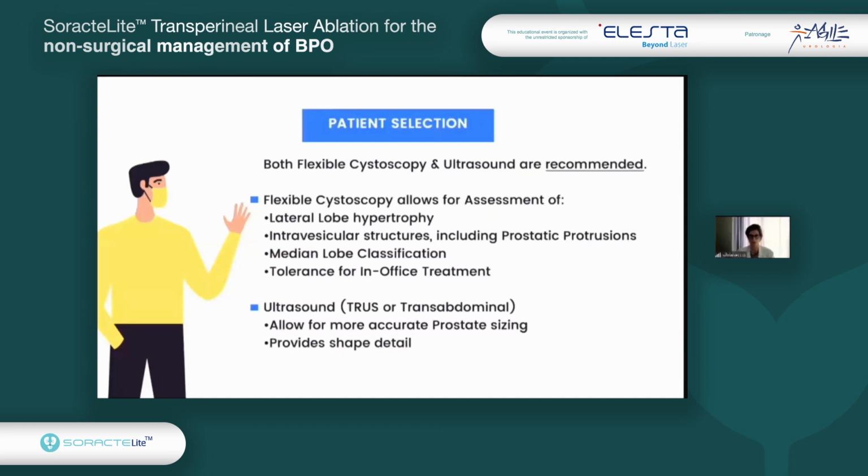It can be a transabdominal or transrectal ultrasound, but we have to know how the prostate is in terms of dimension, in terms of shape, and whether there is any kind of stenosis or something that can make the procedure difficult. So we have to collect as much information as we can to be sure that the procedure will have no complication and no contraindication. The fact that the patient uses anti-aggregation or anticoagulation medication is not a problem. We can perform it as well.